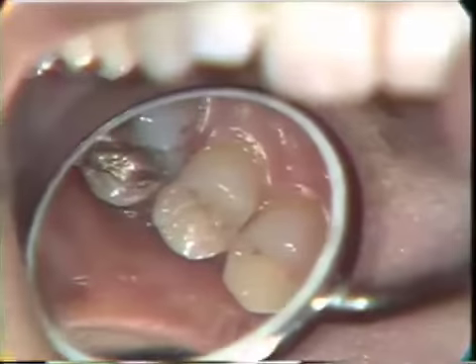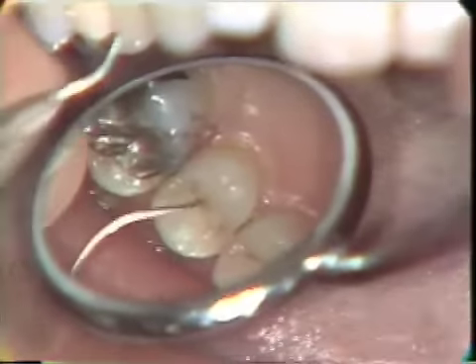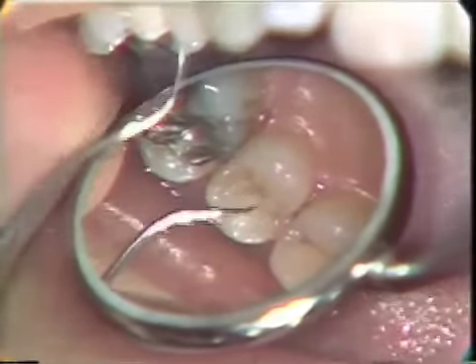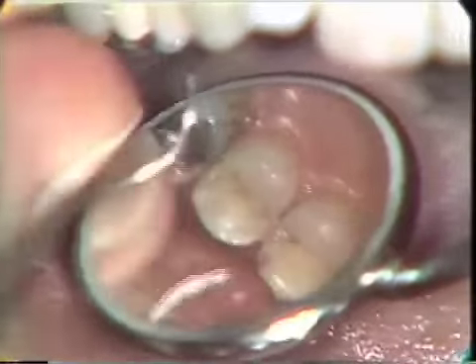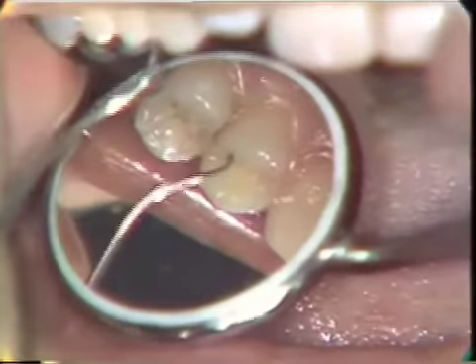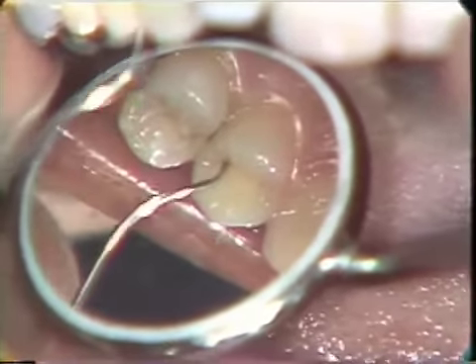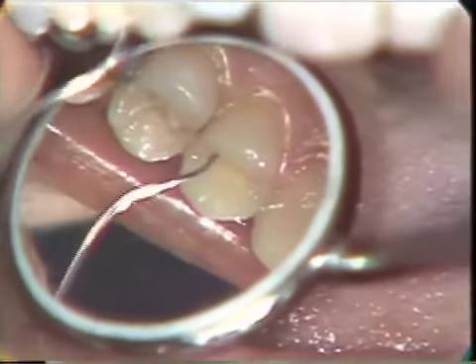After we've done that, we can come into the occlusal surface and check with the explorer, either number 3 or the fine number 1. In the case of number 4, it appears to be some stain, but no break in the occlusal groove. Tooth number 5 does show a catch in this distal occlusal pit. The explorer tine will spring away and has a very definite catch.